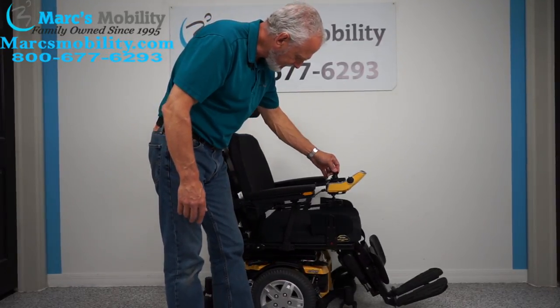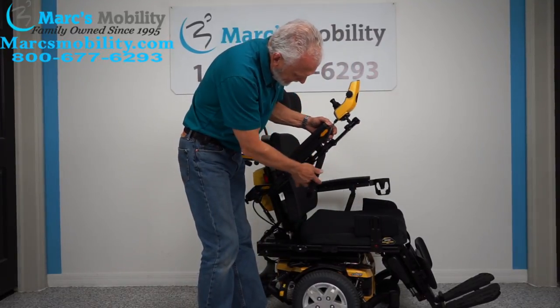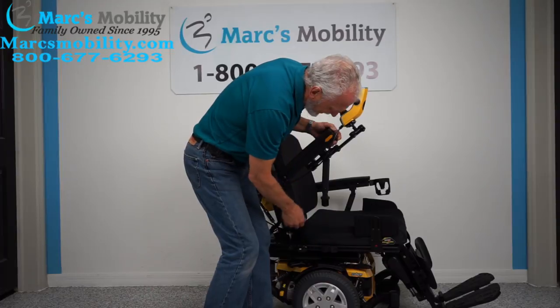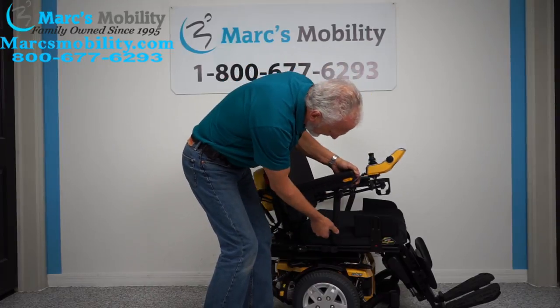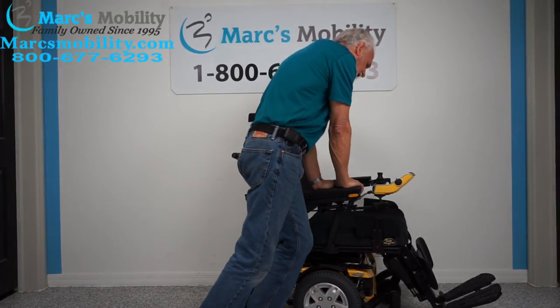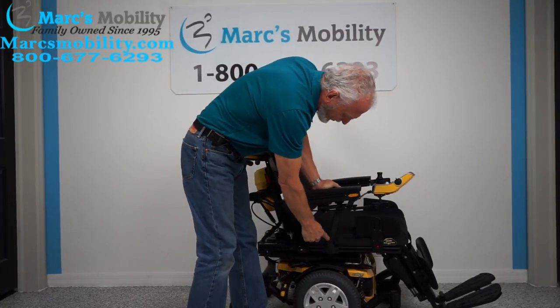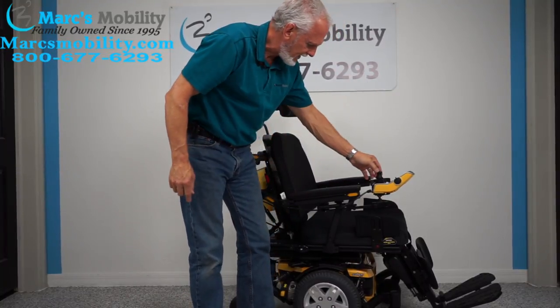These arms have arm support. If I raise the arm, you can see the arm support came out of this ridge right here. If you don't have these arm supports it's okay, but now look — I can push as hard as I want on this chair and this arm does not give because it has the arm support. You have that on both sides.